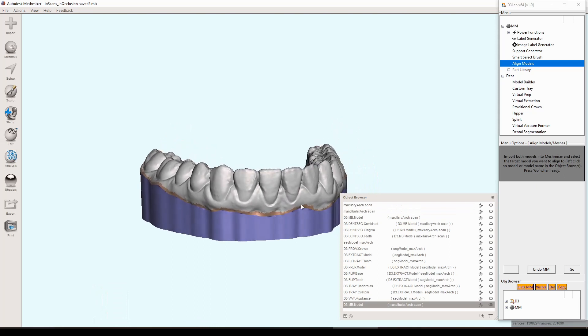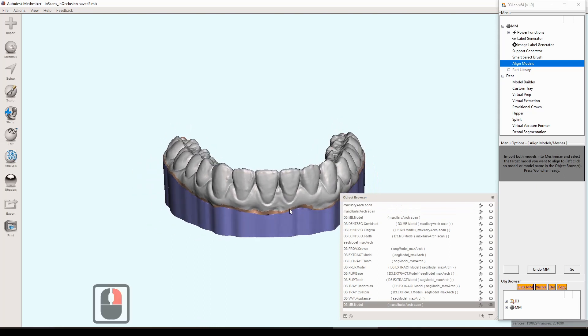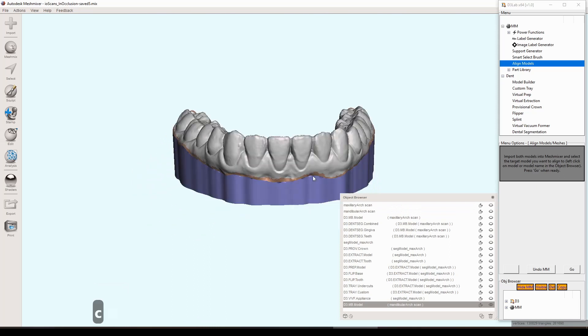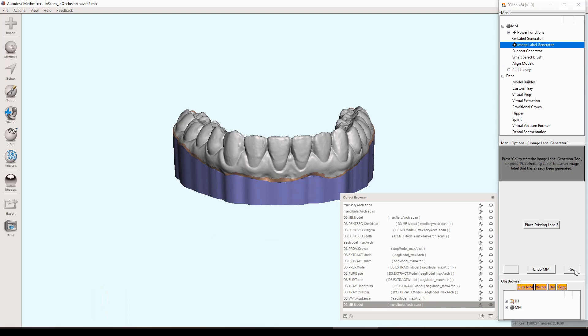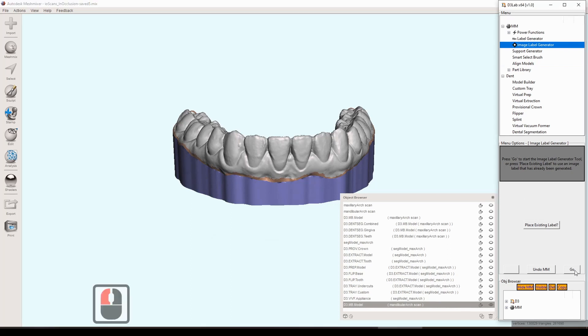We'll go ahead and start with the image label generator because it is something that is brand new. In d3 mesh you can only do text labels. Now in d3 lab you have the ability to do both text and image labels that includes logos, pictures, pretty much anything. The image label generator creates these stencils and then labels from those stencils that you can apply to any model within mesh mixer.